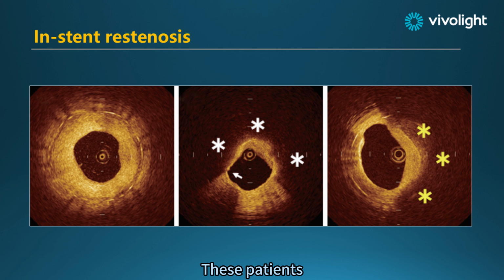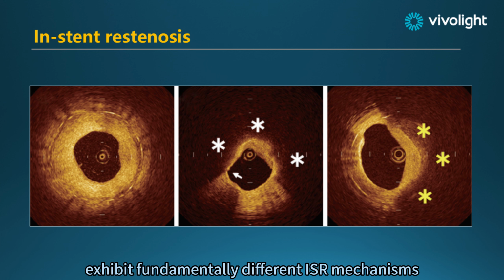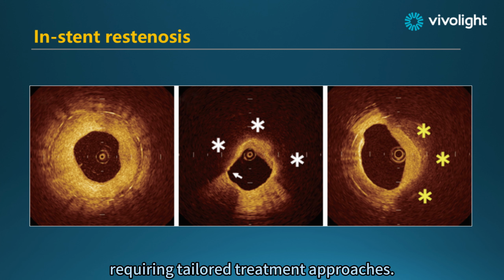These patients exhibit fundamentally different ISR mechanisms, requiring tailored treatment approaches.